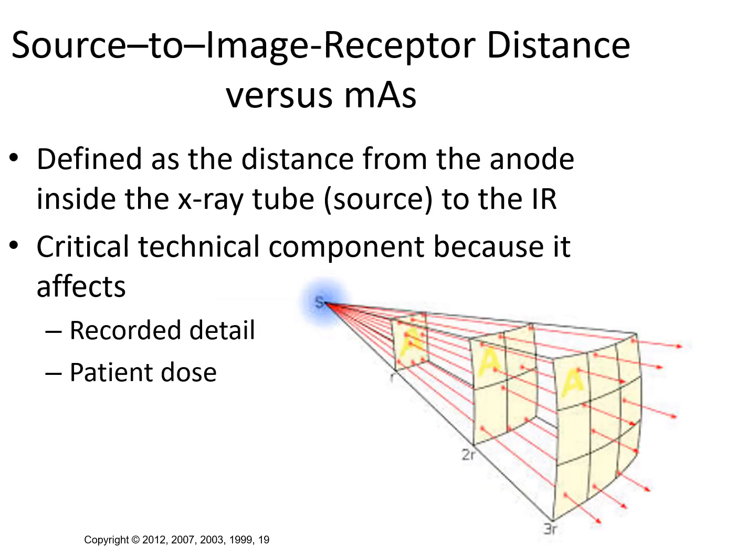All right, so another technical factor, it's really a geometric factor, but it's included in the technical factors, is source to image receptor distance. What this diagram explains, you intuitively understand. This is called the inverse square law. As you get farther from a source of radiation, the radiation spreads out over a larger area, and so the intensity is reduced per unit area.